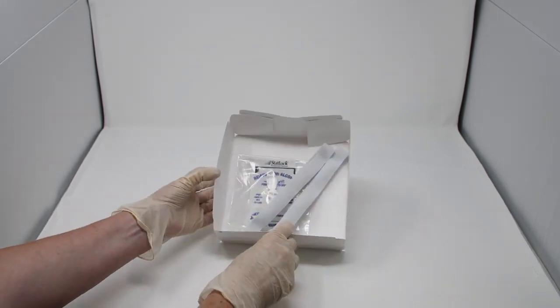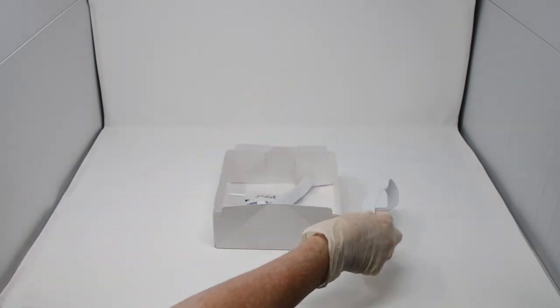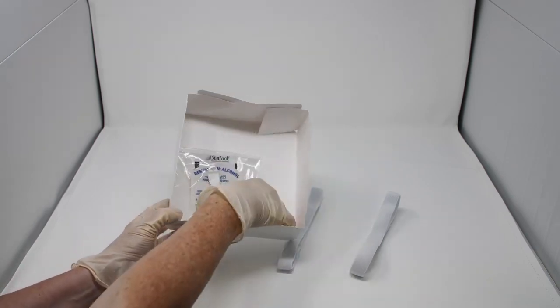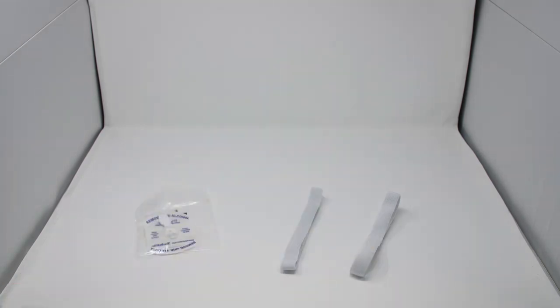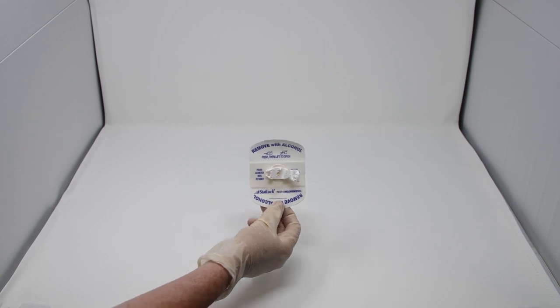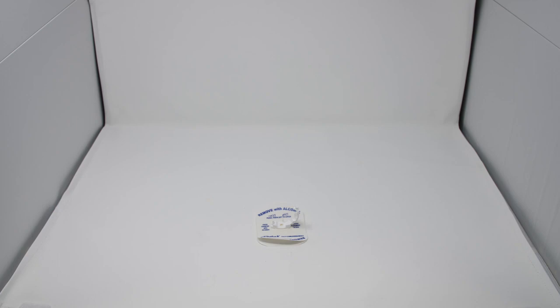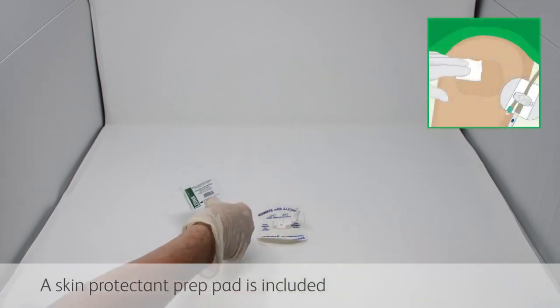Finally, there are the leg bag straps, only in the leg bag tray options, and the STATLOK Foley catheter stabilisation device. Trauma can be caused by not securing both the catheter and bag and can have long-term effects for the patient. Both EPIC-3 and RCN guidelines support the use of catheter securement devices. The STATLOK Foley stabilisation device is one form of fixation that meets all the requirements for stabilising a catheter to prevent movement, friction and tearing of the delicate urethral tissue.